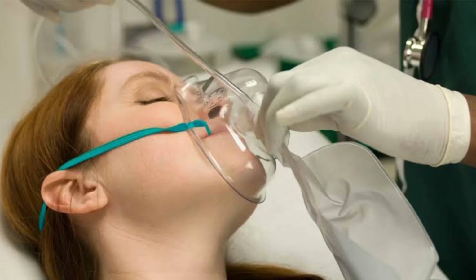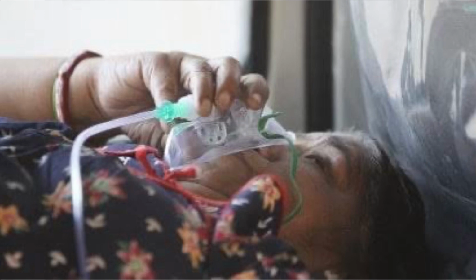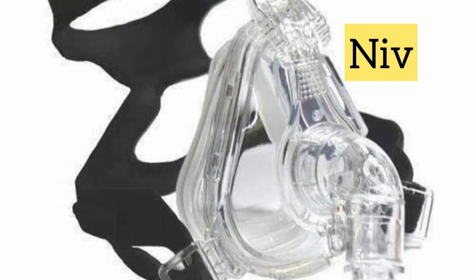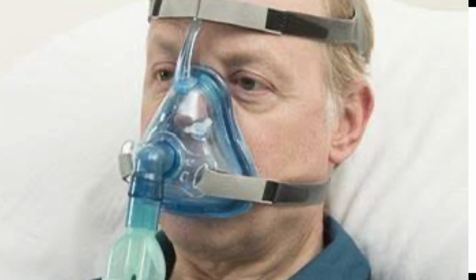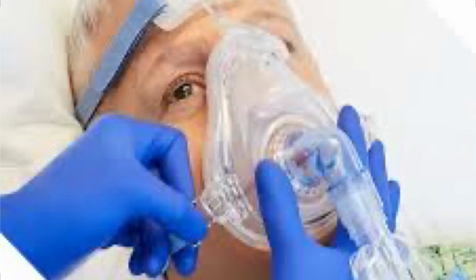It provides high oxygen concentration used in acute respiratory distress, severe hypoxemia, and conditions requiring high oxygen concentration such as pulmonary edema or severe acute exacerbation of asthma. This is NIV. This mask can provide up to 100% of FiO2. This mask fits over the mouth and nose and is connected to the ventilator that provides pressurized air. They help improve oxygenation and reduce the work of breathing.